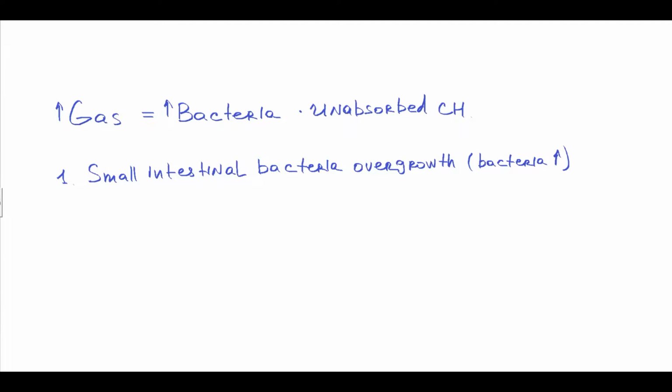The second condition is related to carbohydrate malabsorption, for example lactose intolerance, when there is an increase in unabsorbed carbohydrates, and with the rise in substrates of bacterial fermentation there is an increase in gas production.